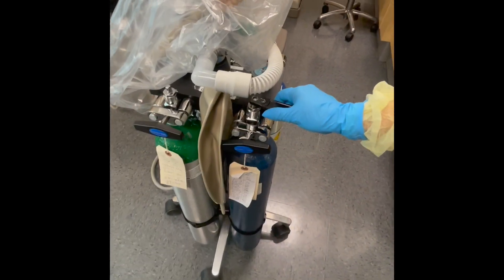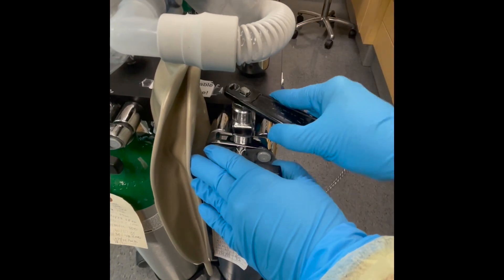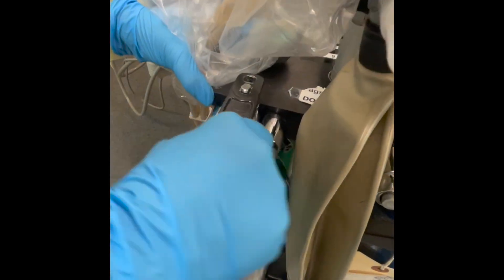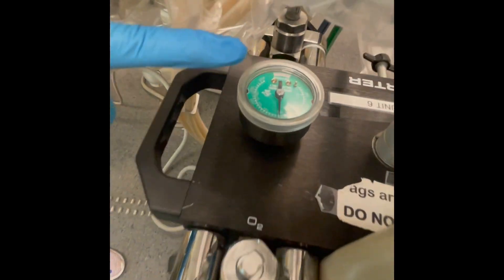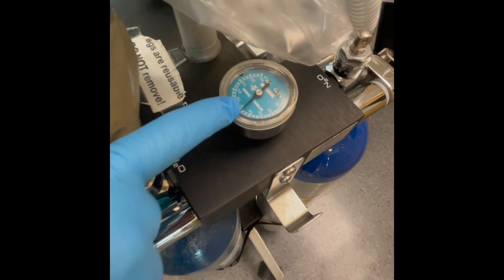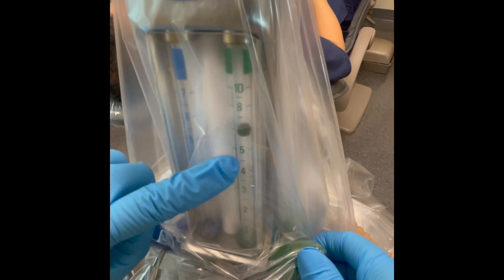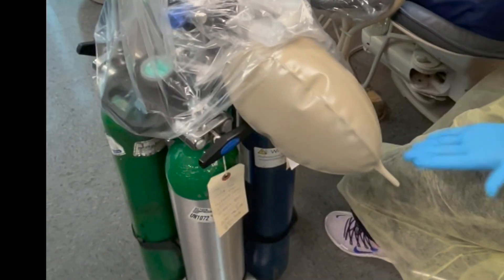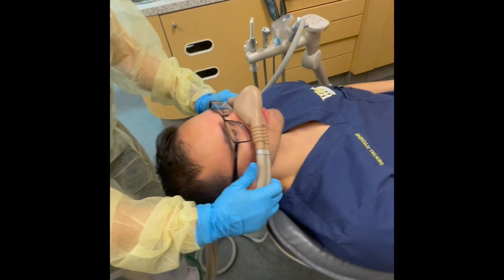Now that it's all assembled, open the tanks you will use. Start the flow of oxygen at 6 liters per minute. Ensure the bag is inflated — remember, this is to be done before placing the nasal hood on the patient.